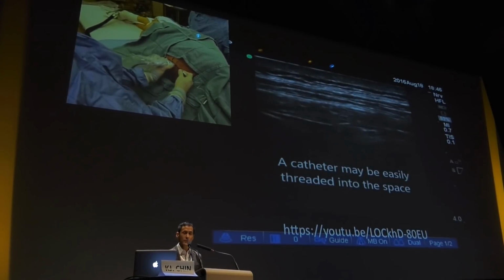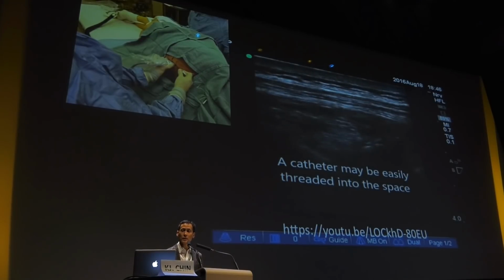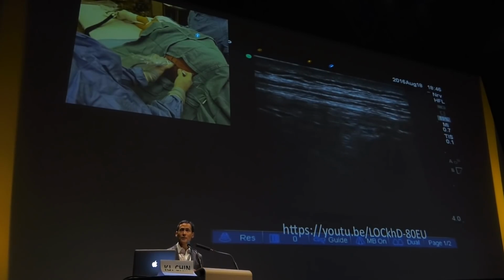And if you want, once you've opened that space, you can easily put a catheter into it as well, which you can then use for topping up or running infusions.